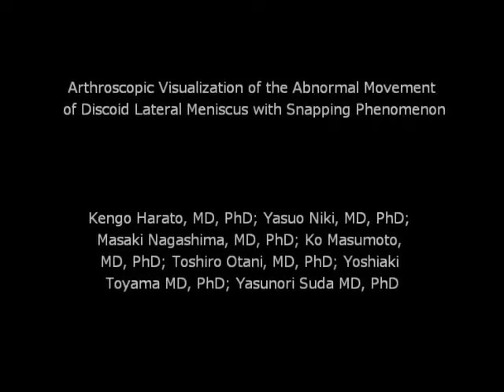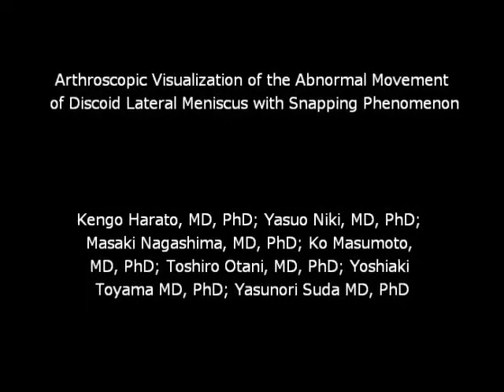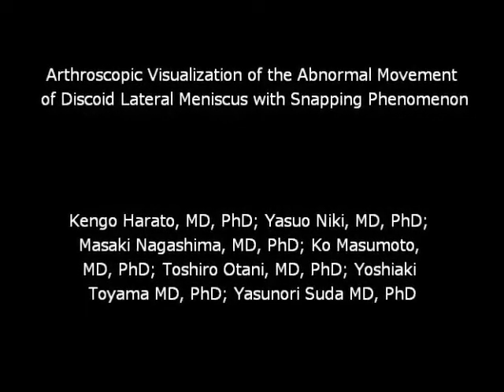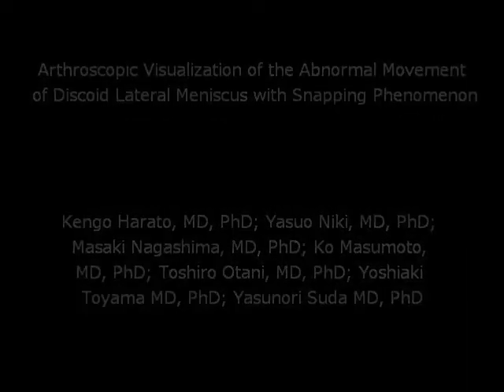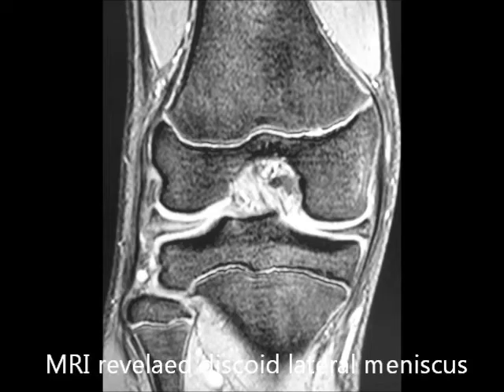This video introduces arthroscopic visualization of the abnormal movement of discoid lateral meniscus with snapping phenomenon. The first case is a 13-year-old male whose chief complaint is symptomatic snapping with motion on his right knee. MRI reveals discoid lateral meniscus with horizontal tear.